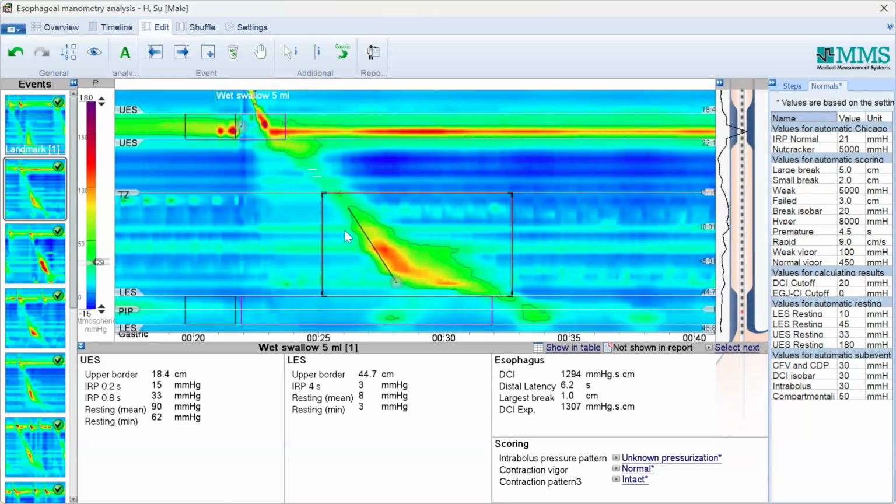Based on this number, we will judge if it is normal or abnormal, ineffective motility. So we have to make sure that this box is in the right position. If it is placed differently, you can see the value decreased. Maybe later on we can make one episode to talk about this point.